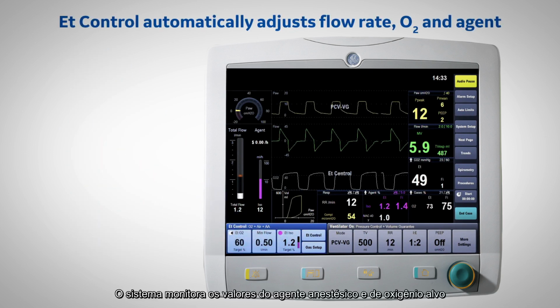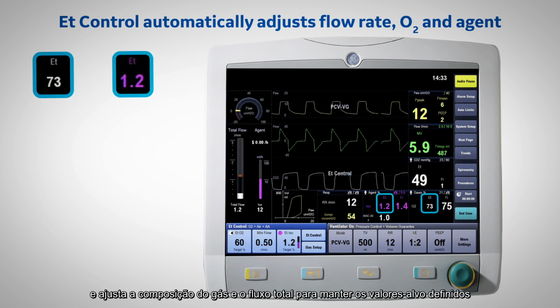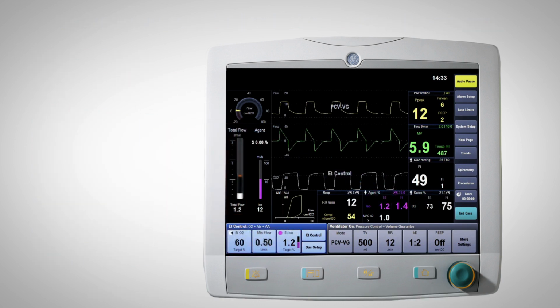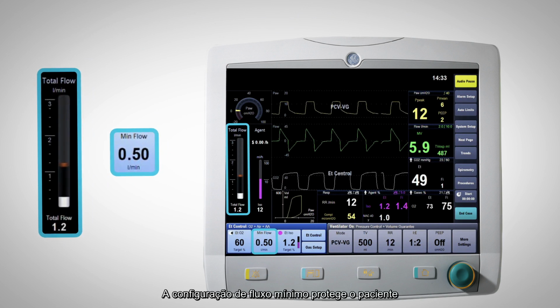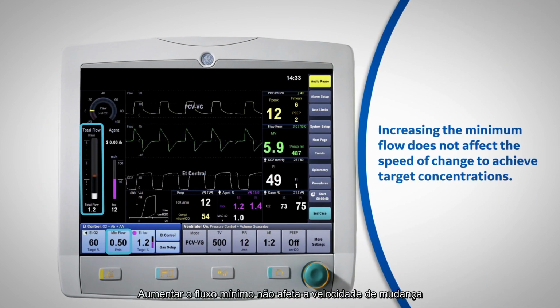The system monitors end tidal oxygen and end tidal anesthetic agent values and adjusts the gas composition and total flow to maintain the set target values. The minimum flow setting safeguards the patient by maintaining at least the minimum set flow delivered to the patient. Increasing the minimum flow does not affect the speed of change to achieve target concentrations.